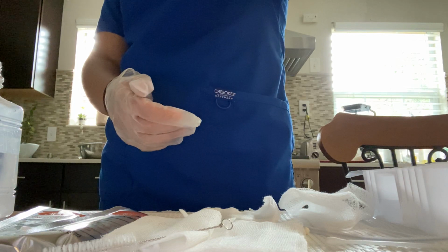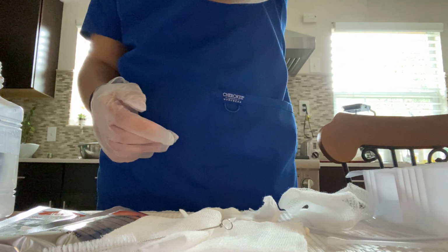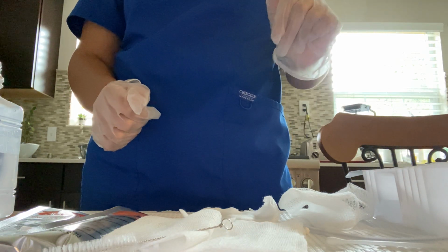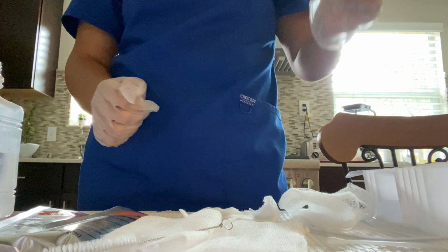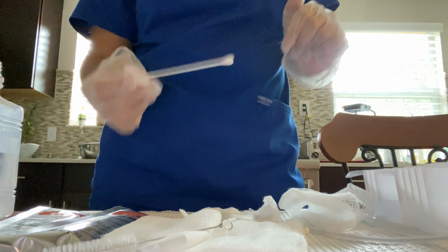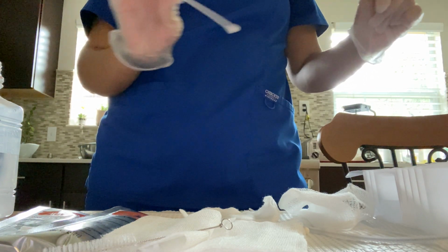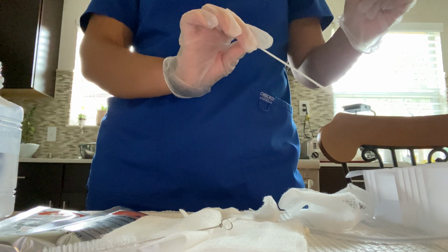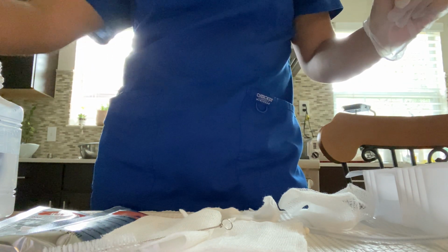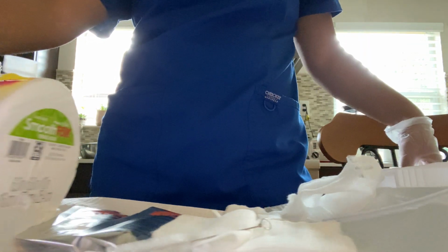All right, after I put the trach in with my dirty hand, the sterile part is over. So I just put it in already. This is my dirty hand. Now we're going to clean the outer part of the trach. Since the sterile part is over, I'm going to grab a Q-tip. I'm going to dip it in the clean saline. Sorry, let me scoot my guy in a little more.